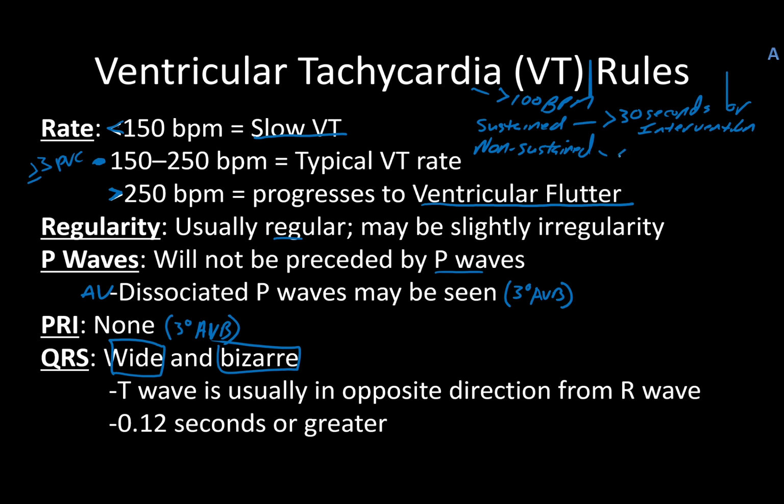Non-sustained is less than 30 seconds, and the patient really has no symptoms. It's not a problem. It happens and goes away. And that's why that count is so important, that you say it's a run of 5, 10, 52. I hope you don't say that, but how many beats of V-Tach there are. Because if it's a full 20, 30 seconds, that very much changes the way things look as opposed to a 5-beat run of V-Tach. You know what I mean?